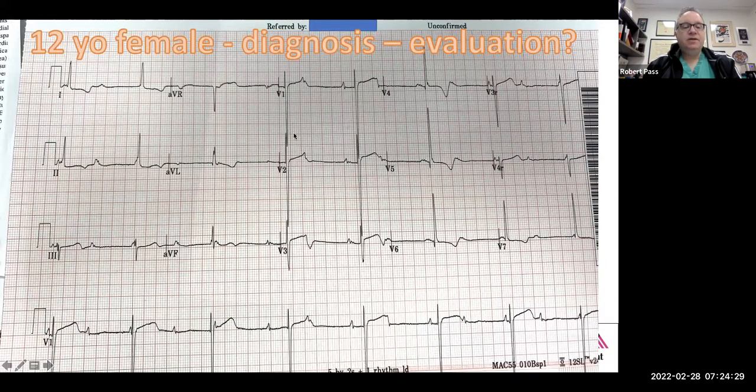All right, this is a 12-year-old patient who presents after a syncopal episode, and we're trying to figure out what is going on here. I'm going to ask Dr. Barris what he thinks about this.